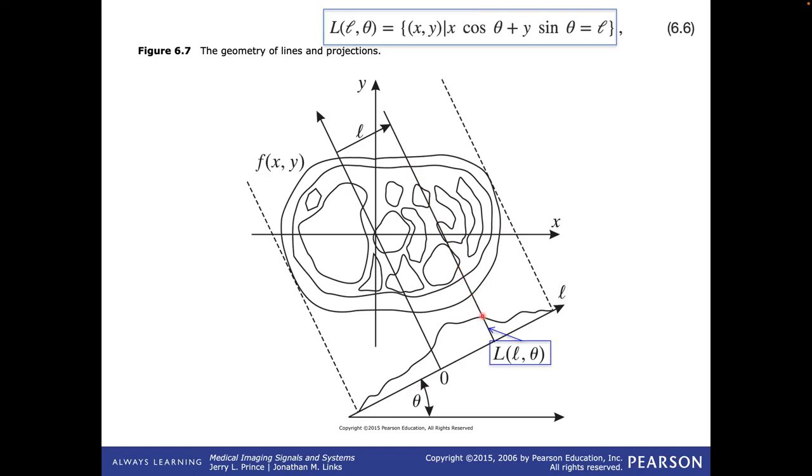We're going to measure, as you might imagine, we're going to send X-rays from our source up here. They're going to come through a straight line, hit the patient here. Some will be absorbed, and then X-rays will be emitted out the back of the patient, those that didn't get absorbed. And then we'll detect them on our detector, and the position at which we detect them will be parameterized by this value of L. So there's one scalar value here, L, and an angle theta. So we're going to change that angle and measure a number of those projections.